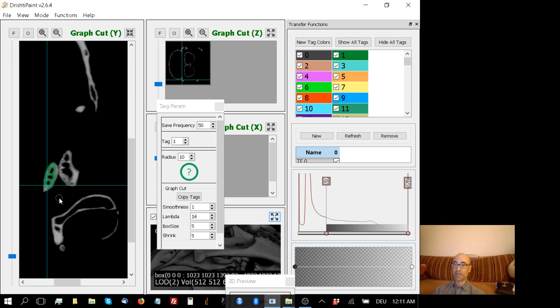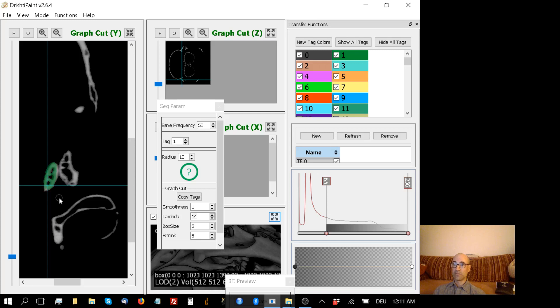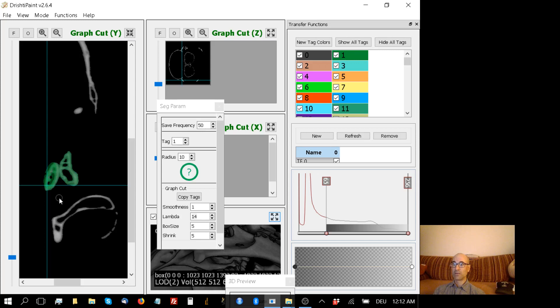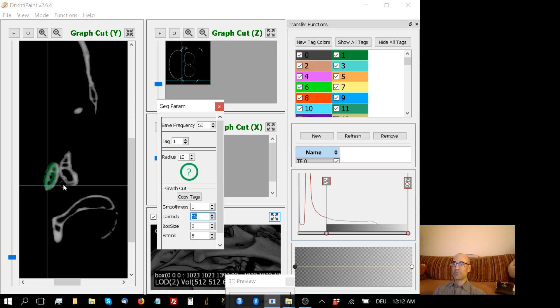T for tag. It worked. With lambda 14, I hit the right arrow key, do the same thing. T for tag. Looks like it's working. T for tag. Yep. Right arrow key. T for tag. Right arrow key. And I'll just go through a bunch of these. And with any luck... My luck went out. I hit R to get rid of that. And maybe I can bounce it up one more. Let's see if that's going to work.